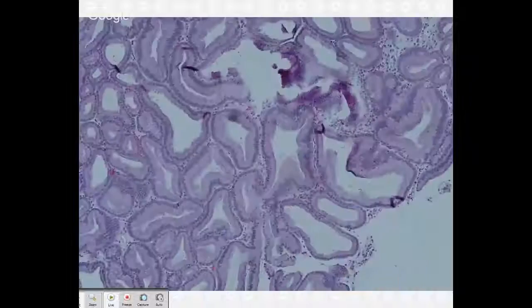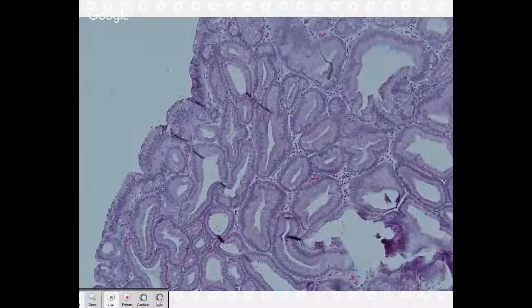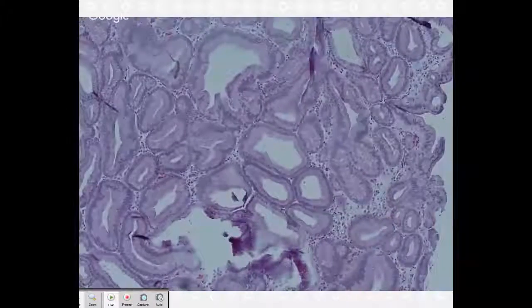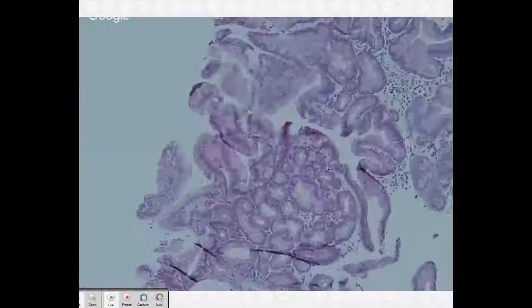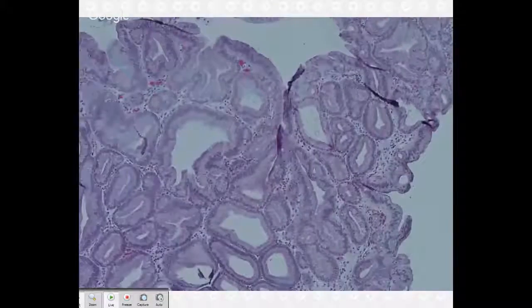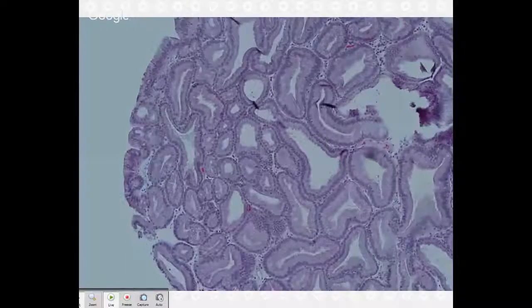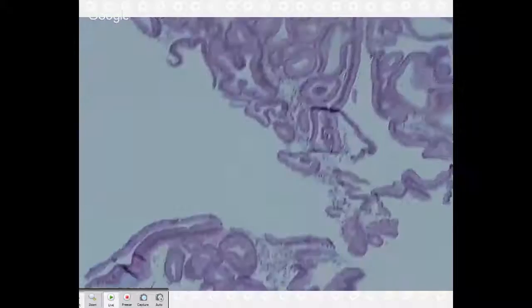It looks a little different. Anybody have a name or want to throw out what they think this entity could be? I just told you it's not a typical intestinal type adenoma because the cytoplasm doesn't look right for it. So that takes one thing off your differential. Oh, nobody? You said the patient has multiple polyps, right? So again, it's part of some syndrome, number one. Could be. And age is 45. I was maybe thinking if it is part of something like Cronkhite-Canada syndrome.